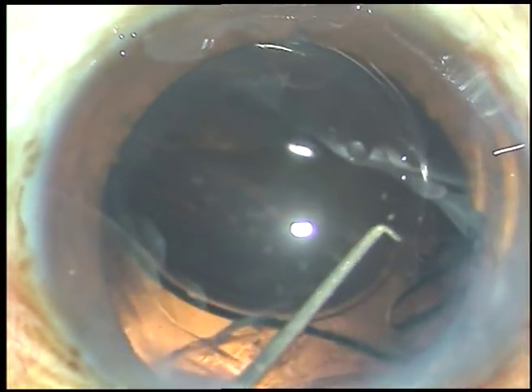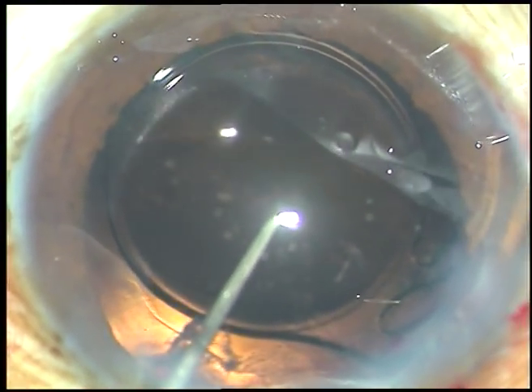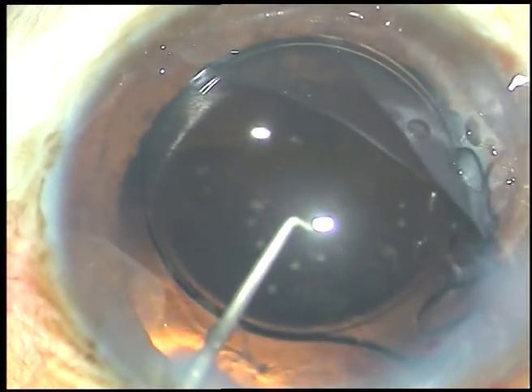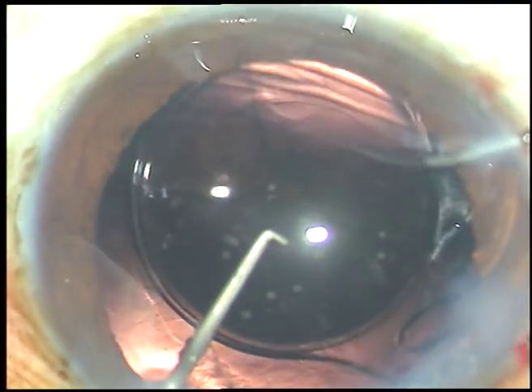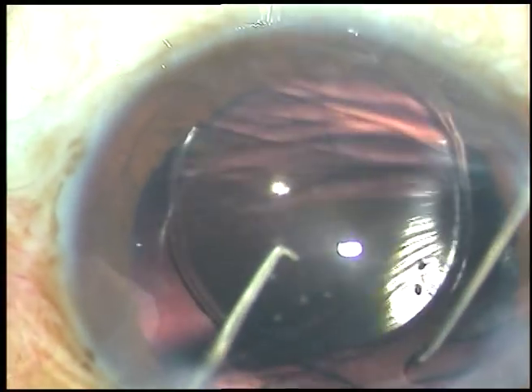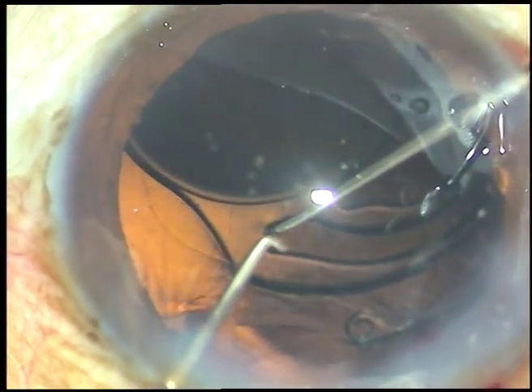Now I am using a Sinskey hook through the side port at 8 o'clock. The chopper, which is being introduced through the 2 o'clock side port, is just supporting the anterior surface of the lens. The Sinskey hook is dialing the lens into the capsular bag.